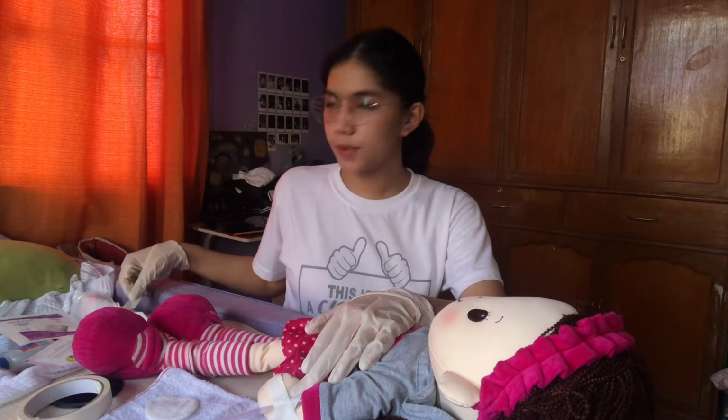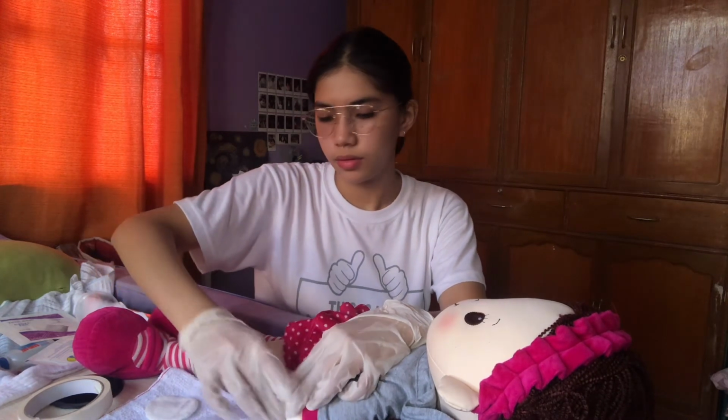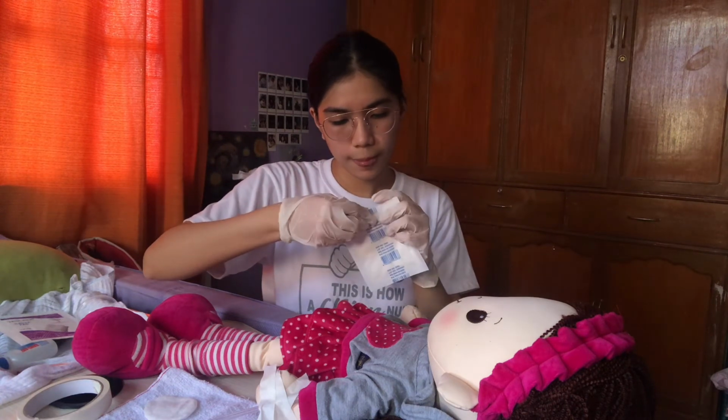For a catheter, we will apply the tape using U method. Then we will apply gauze dressing to the IV site.